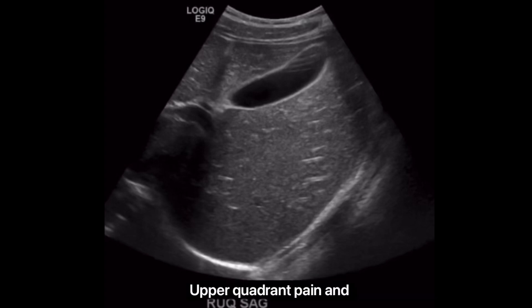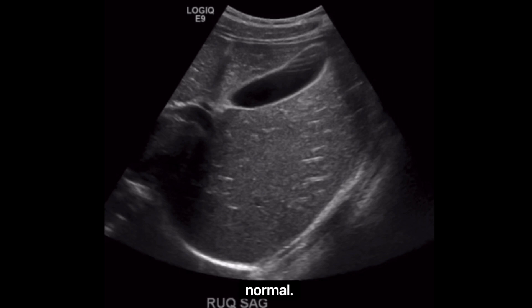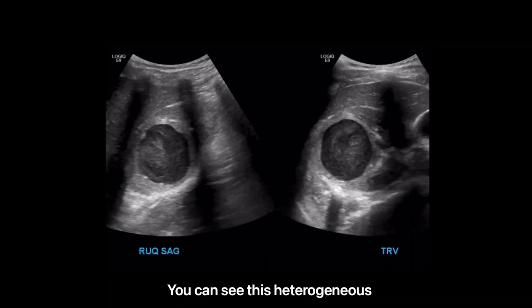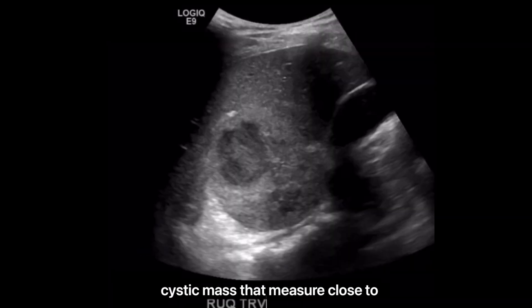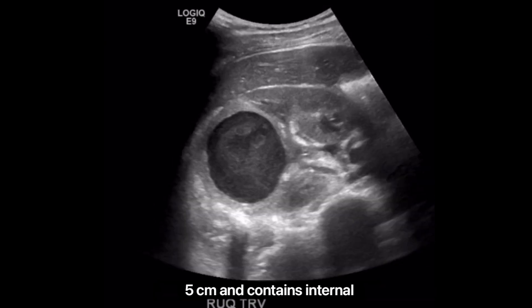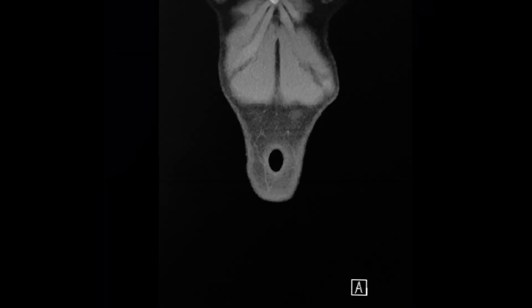We have a patient with right upper quadrant pain and leukocytosis. The gallbladder and appendix were normal. In the right upper pole of the kidney, you can see this heterogeneous cystic mass. It measured close to 5 centimeters and contains internal debris, with no vascular flow.